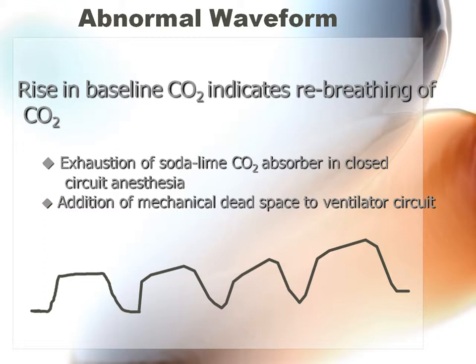If they've not been breathing for a while and you put that on them, it's going to be really high at first, right? Eventually, if we're ventilating for them, it should tick up really high, and then it should regulate back to normal, if respiratory depression is the only issue. If it's a metabolic issue, we'll probably just have high CO2 and a mismatch somewhere else. If it's a metabolic issue and they're septic, we might just have high CO2 the entire time. Does that make sense?